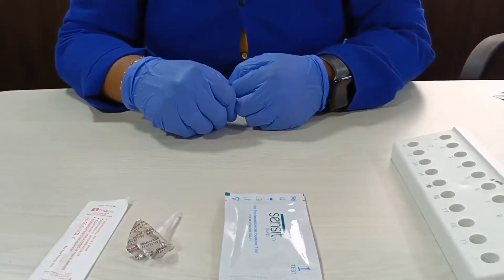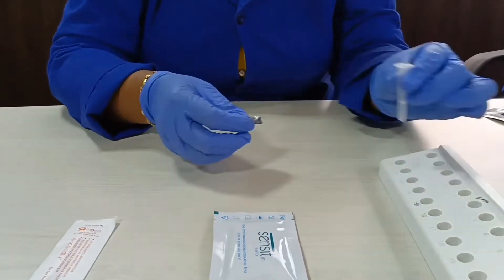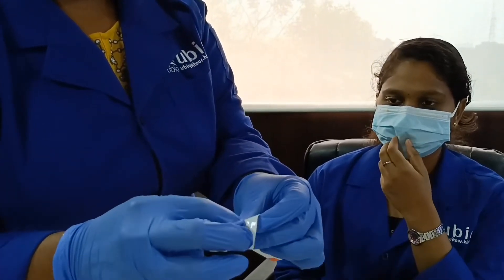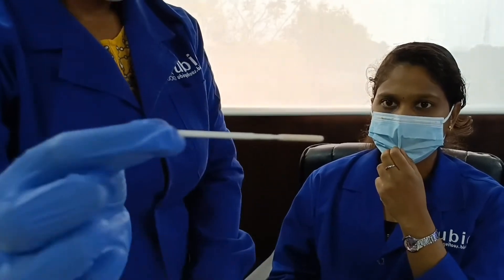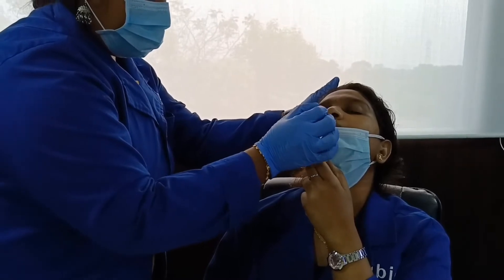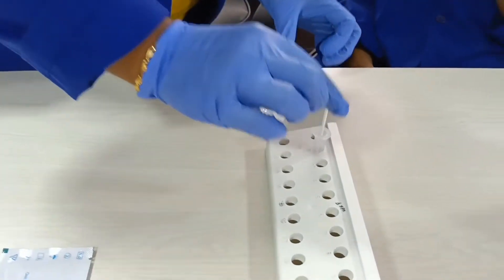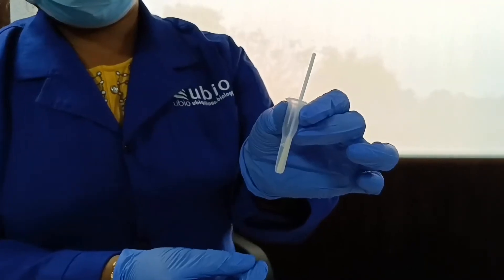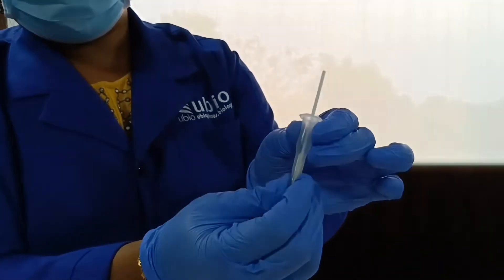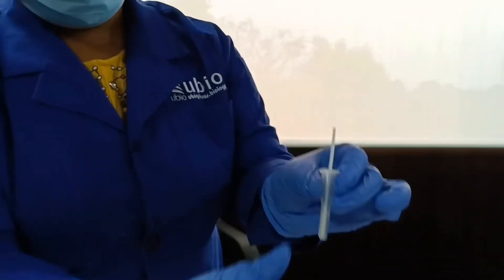Here we go with the demonstration. Peel off the buffer tube seal and keep it aside. Insert the swab into the nostril of the patient. Swab over the surface. Withdraw the swab from the nasal cavity and dip it into the buffer tube. Extract the swab specimen into the buffer by squeezing the sides of the tube. Keep the tube aside.